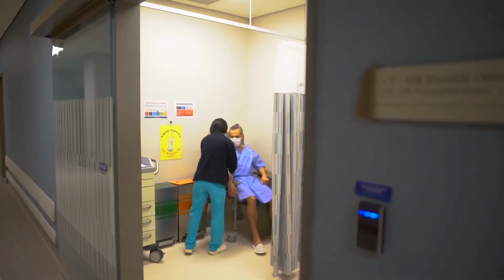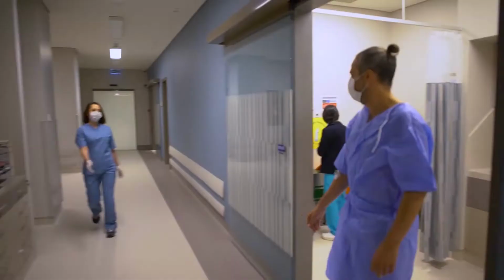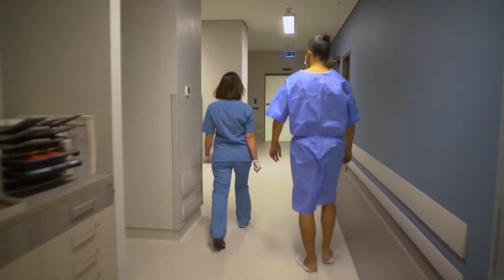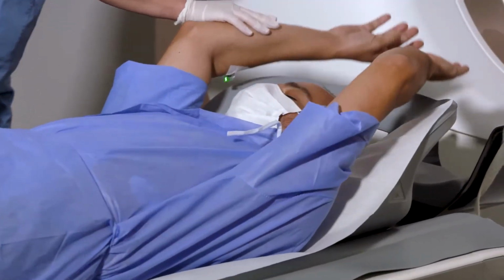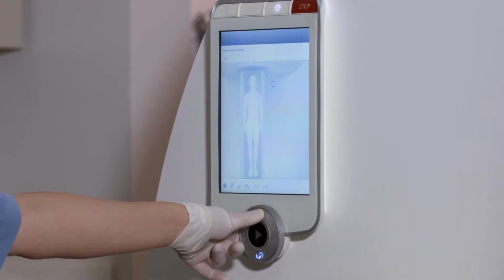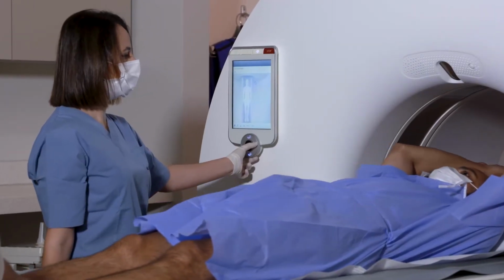Structural deformities and diseases of the coronary arteries can be visualized with tomography scanners within a very short period, less than 1 second, during administration of an iodinated contrast agent in low doses into the vein of a patient's arm.